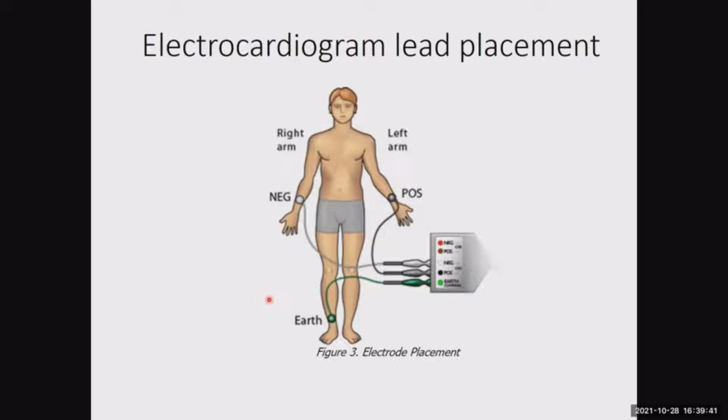Now, like we've seen in the past, if these electrodes are a little bit loose, or if you haven't cleaned the skin and used some electrode gel, you may not get a good connection. And so you want to make sure that the leads are attached, that you've got a good quantity of the electrode gel that doesn't interfere with the ability of the electrode to stick to the skin of your subject, but still allows for the picking up and the reading of these electrical signals.